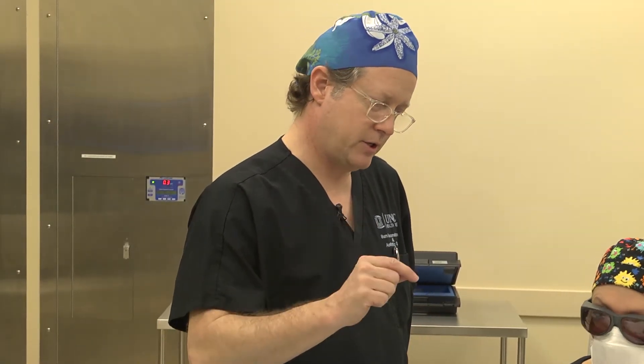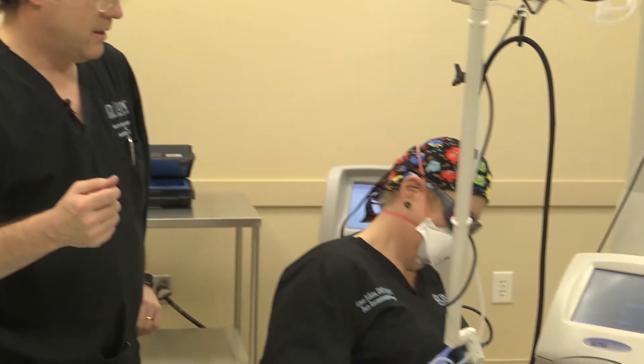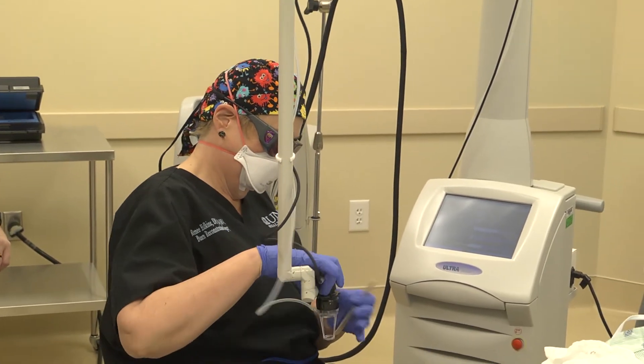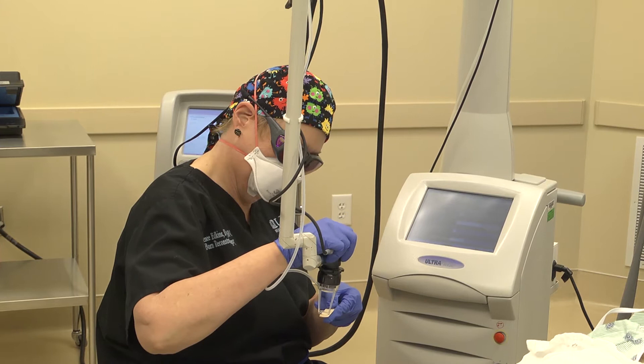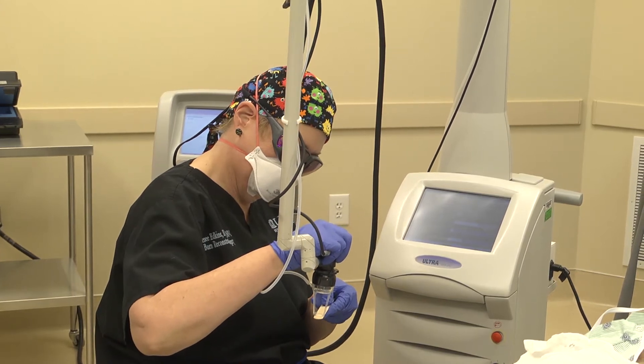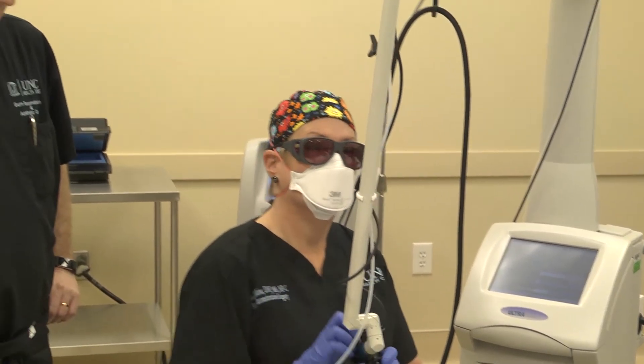We're going to be using the laser today on a patient with some burn scars. This is our fractional CO2 laser, used to soften up the scar and make it a little bit thinner. It's also interesting because it cuts holes in the scar, which allows us to deliver drugs like steroids that help to decrease inflammation.